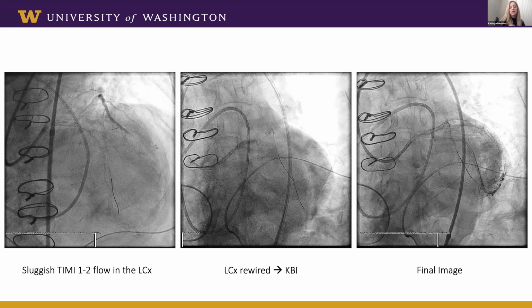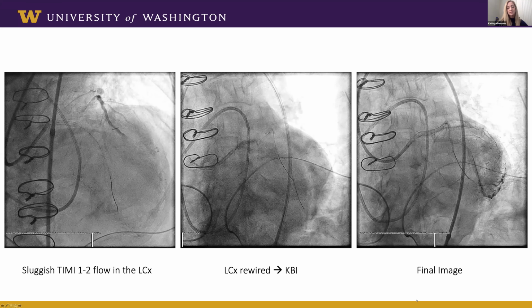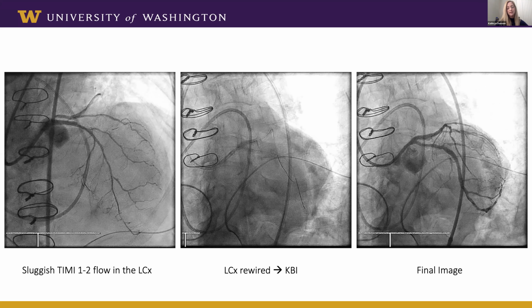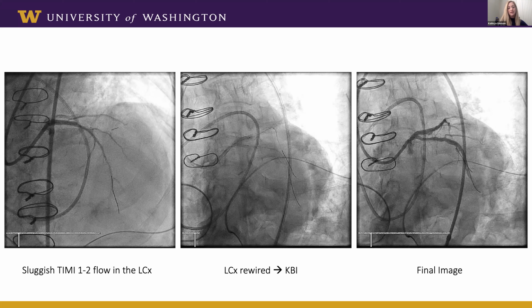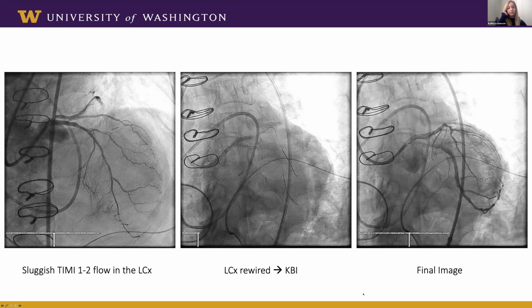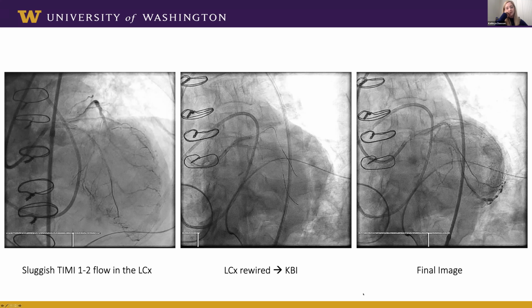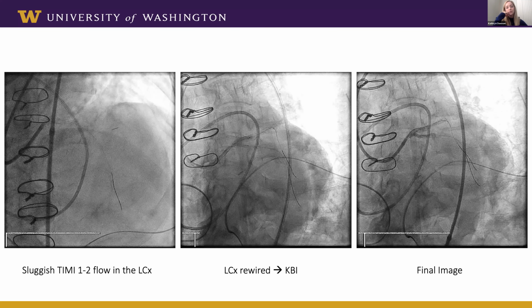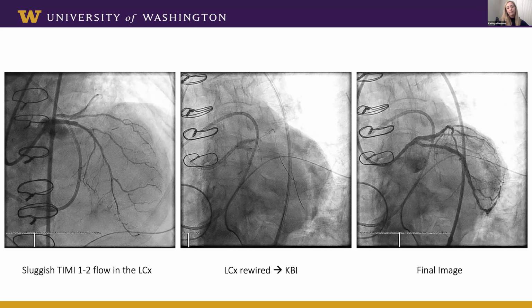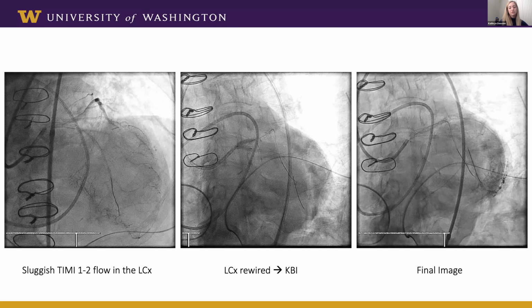So after that, we rewired the circ, did initial dilation with a 2.0 compliant balloon, and then did a kissing balloon inflation with a 3.5 NC in the LAD and a 3.0 NC in the circ. And then did another angiography, which showed great improvement in the flow to the circumflex. So we did not end up doing a TAP or a short culotte in this case. And I think one of the things that Kate and I were talking about earlier was what other people have done differently, what other people have felt obligated to cover the ostial circ after the flow decreased like that. I'd be interested to hear other people's thoughts.